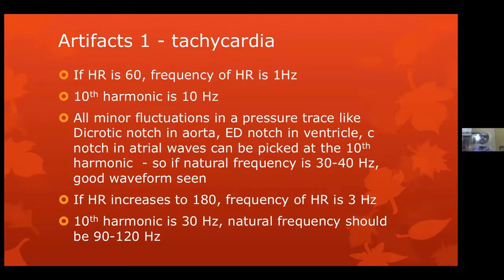If it is not at all coming to that level, that means the natural frequency has deteriorated and so it cannot be used. Many of the machines also have a recalibration button, so it will automatically readjust itself to that 50 and 100 millimeters of mercury. Why I told you about the mercury manometer is, in case you want to check it manually yourself, then you can adopt it.